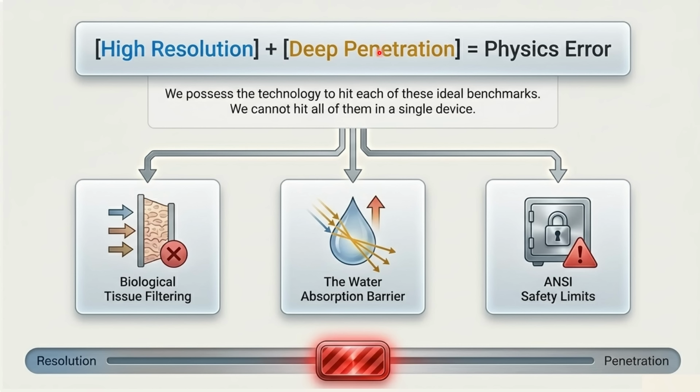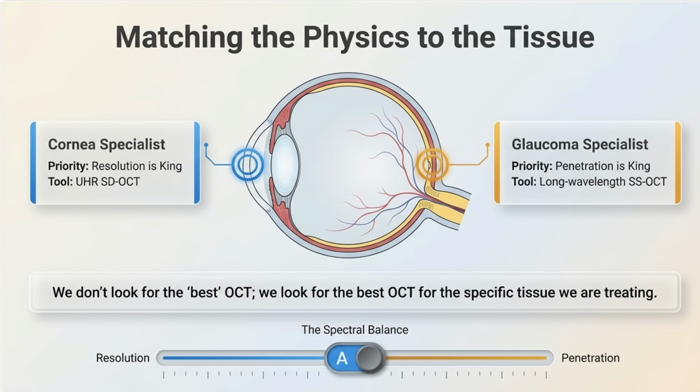Same thing for the penetration. If you have a very high wavelength, due to the total absorption, there will be zero penetration, so you cannot have a picture for any of the structures inside the eye.